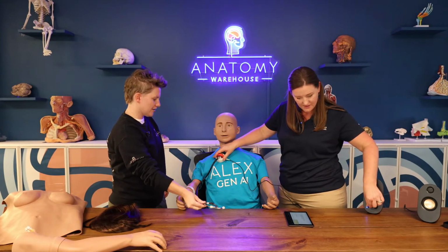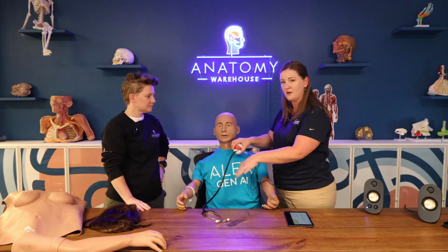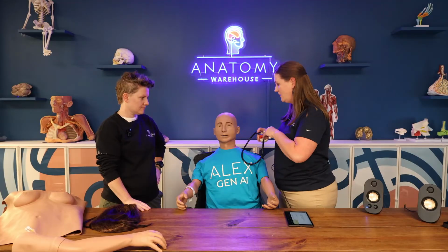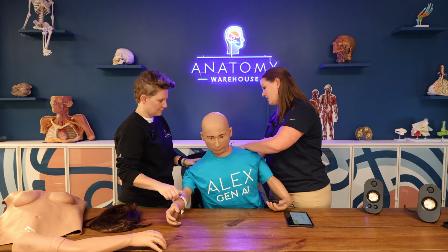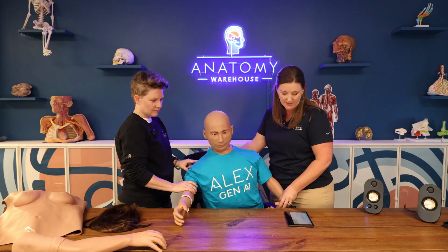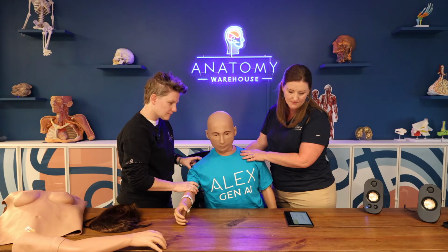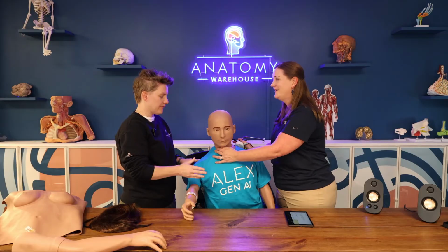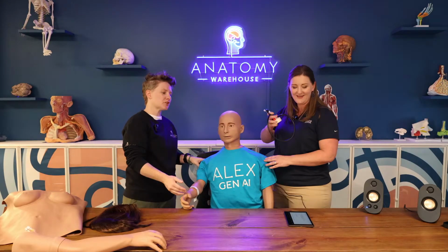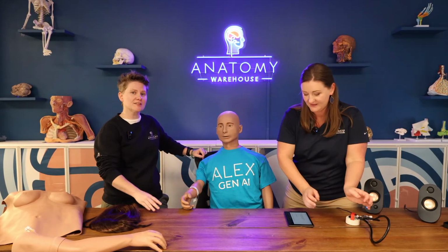Nice breathing, Vivian. Those auscultation points are not only on the front of the mannequin, but also on the back. As you're doing things with the mannequin, we can also hear these sounds, and we're tracking things at the back as well. The logging is so cool. It's not just you doing it, but verifying the steps that you've taken, which is going to be great for feedback from the educators to the students.